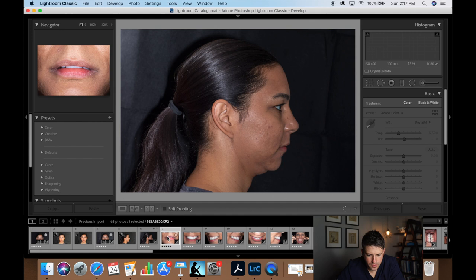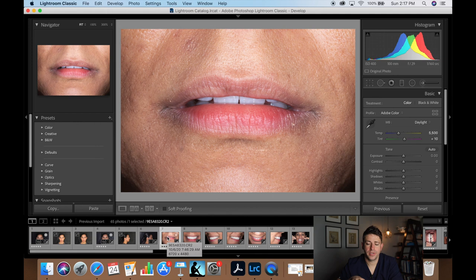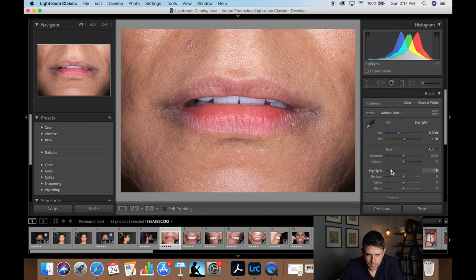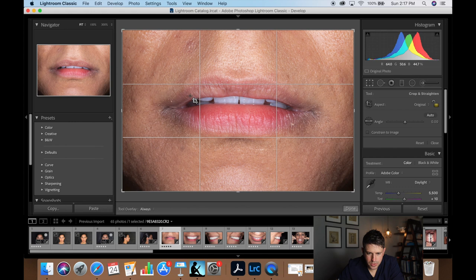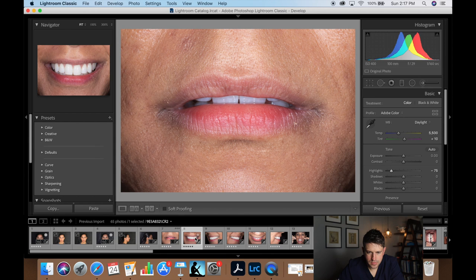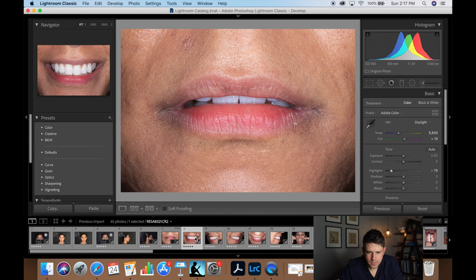Now let's move to the up-close extra-oral images. If you get the composition right on these you really don't have to crop much. The highlights are a little too much so we'll dial those back. As far as cropping, I want to make sure the commissures are level — it looks like there's a slight cant — so I'm going to level up her lips just a little bit.